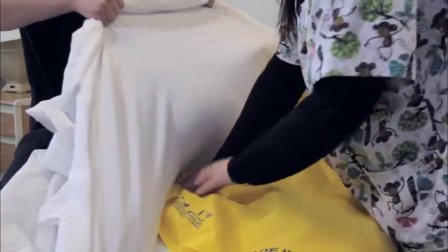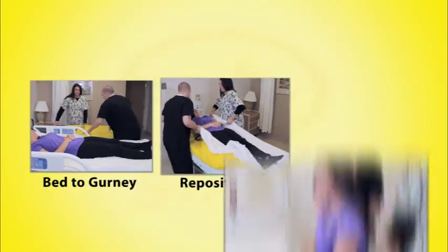Now, step by step, see how easy it is to use Slip the patient mover for transfers from bed to gurney, repositioning, and transfer from bed to wheelchair.